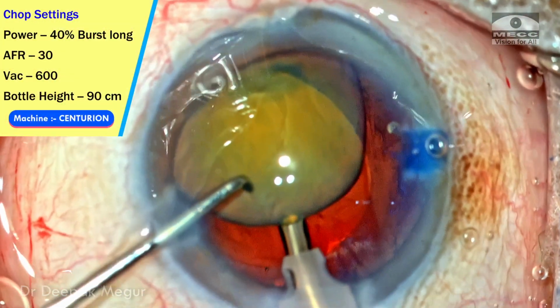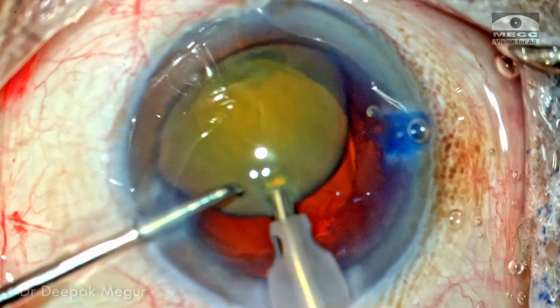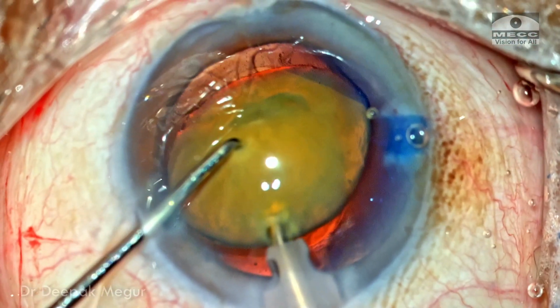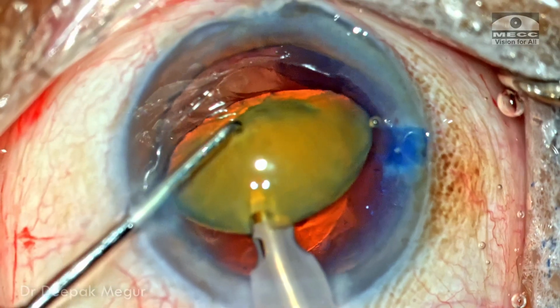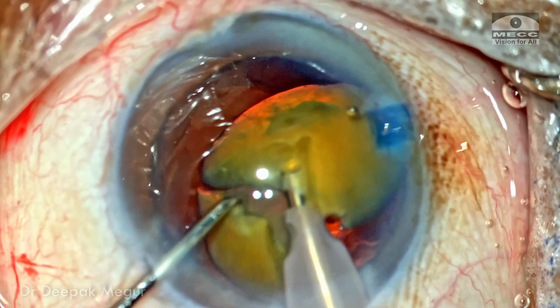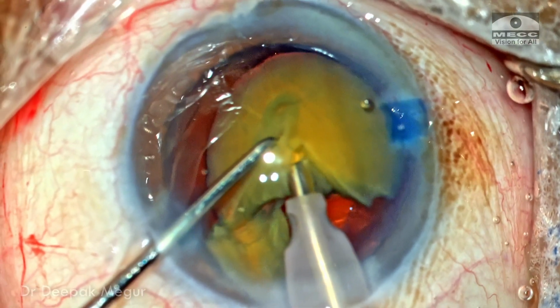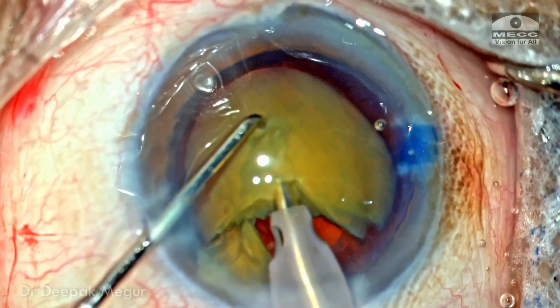I'm going to use the burst mode, the chop mode, to engage the nucleus and then perform the chopping. Thankfully, the nucleus thickness is very less because it's a long-standing sclerotic cataract. So that eases my job. And it is also not very dense. So dividing it is not going to be a major challenge.